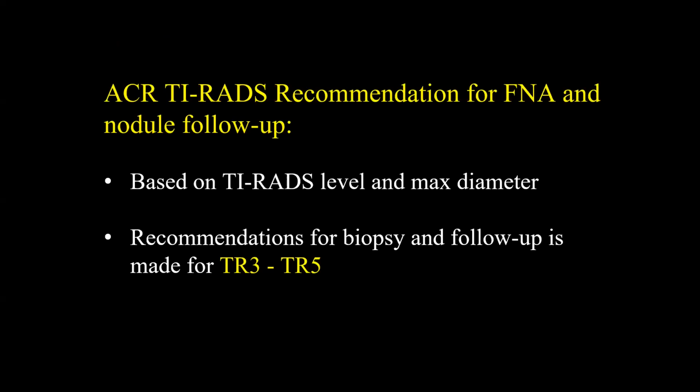So recommendations for FNA and nodule follow-up will be given by the TI-RADS level, which is adding up the points, and the maximum diameter of the nodule. Biopsies and follow-up are for TR3, 4, and 5. TR1 and 2 require no follow-up.